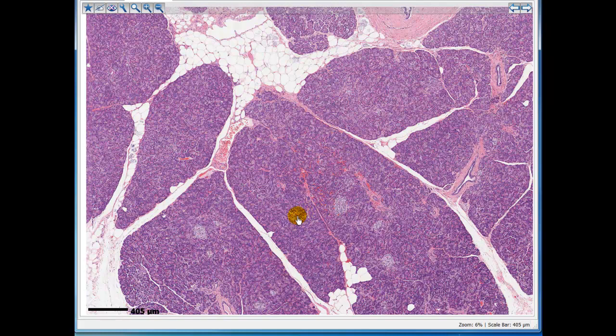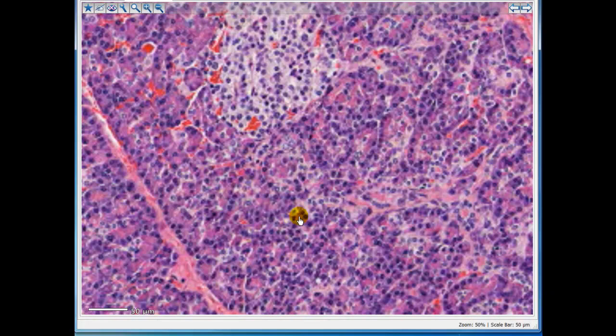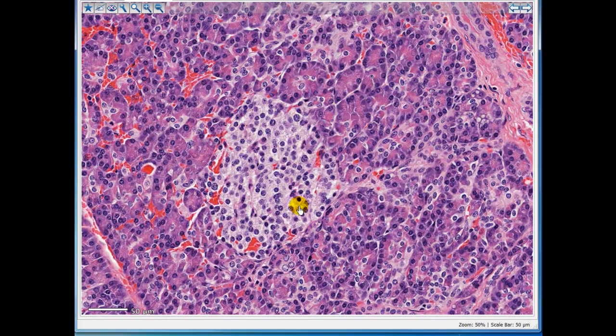The bulk of this pancreas is composed of what we call exocrine gland cells. They produce a product that goes in ducts and is emptied into the intestine. But also there are patches or islands of endocrine cells. These are the islets of Langerhans. And in the islets of Langerhans, there are different cell types, some of them produce insulin, others produce glucagon, and others produce other products that you will learn during the course.